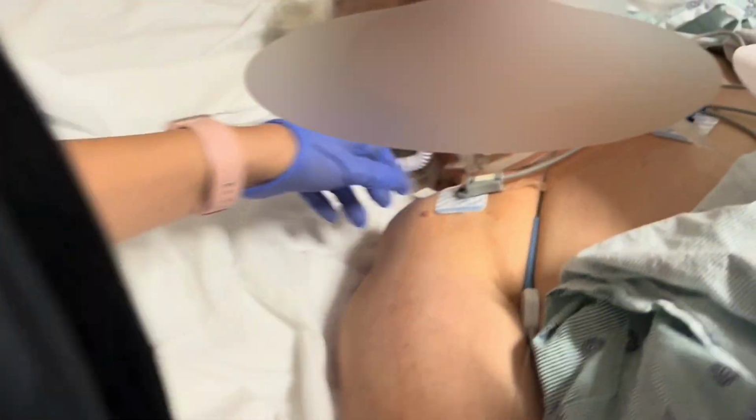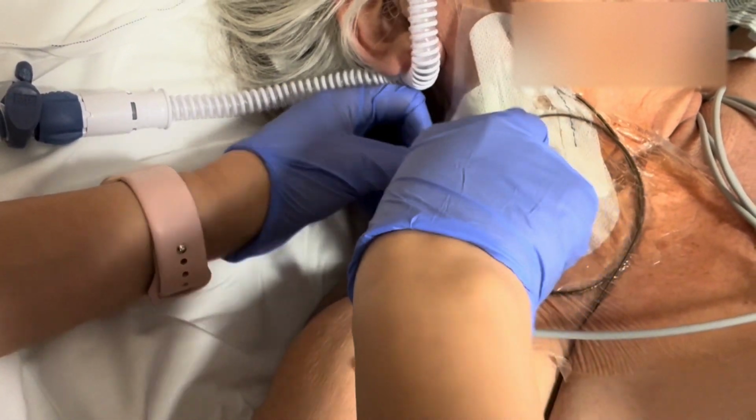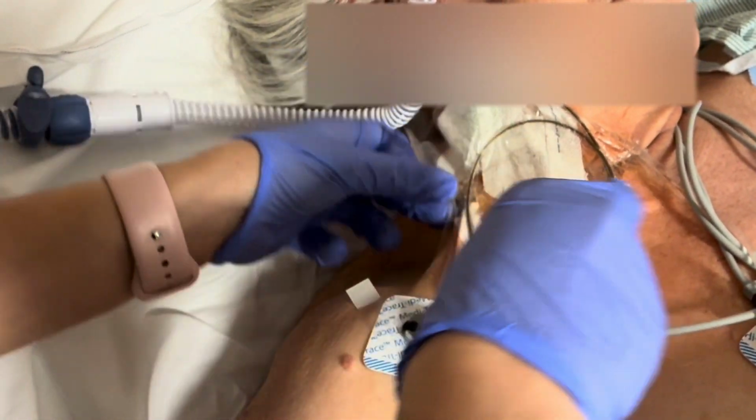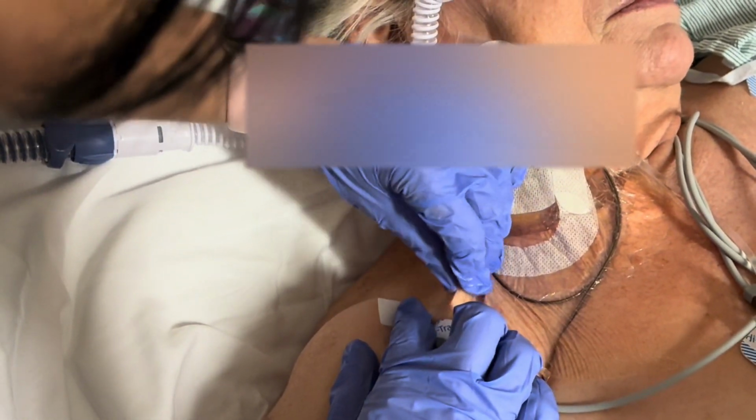Just more here. So, just use this. I'm gonna take this out. We're just taking out the dressing. I'm sorry, ma'am.